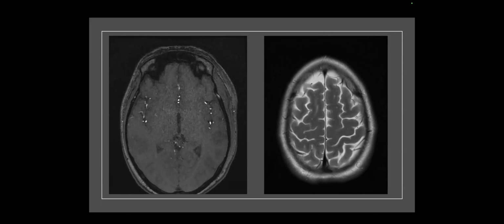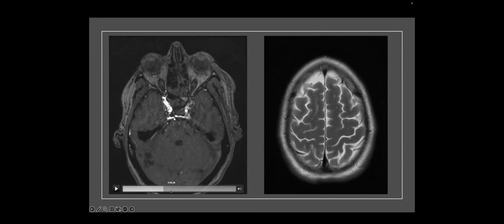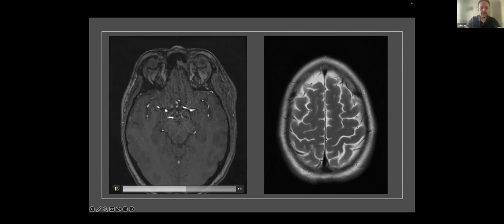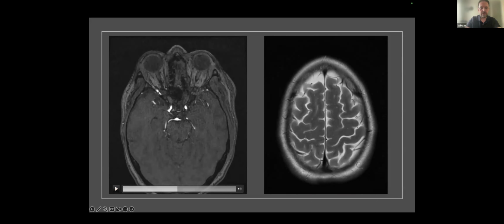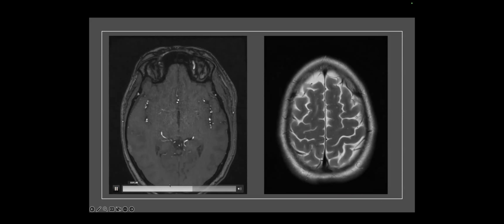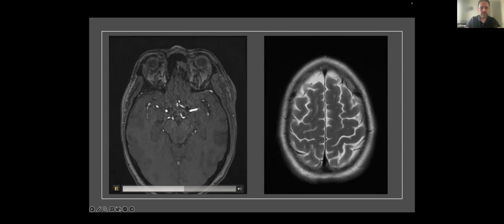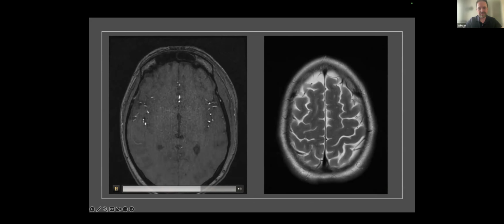Sorry, do you see the cortical venous reflux here? The one you were pointing at looks more like the ophthalmic vein. I don't know if you saw this. It doesn't matter much, but I was thinking maybe this one. That's probably the ophthalmic vein, because I was thinking the ophthalmic vein should be this one here. Yes. Maybe at the origin of the ophthalmic vein, at the foot of the vein. But the angiogram will show, I guess. Exactly.